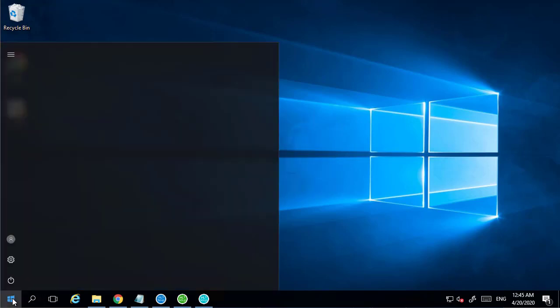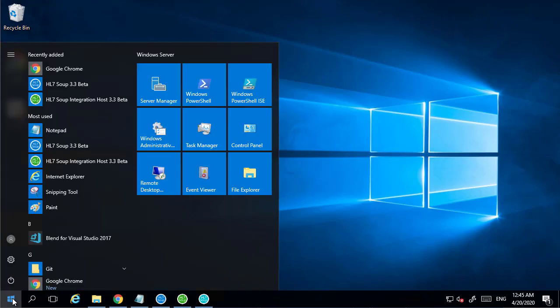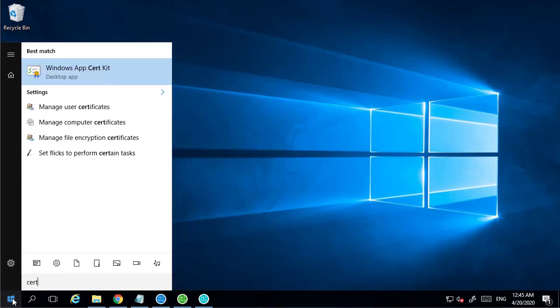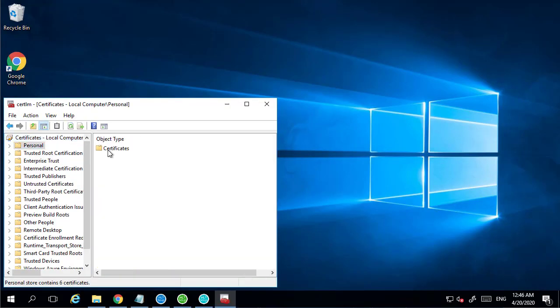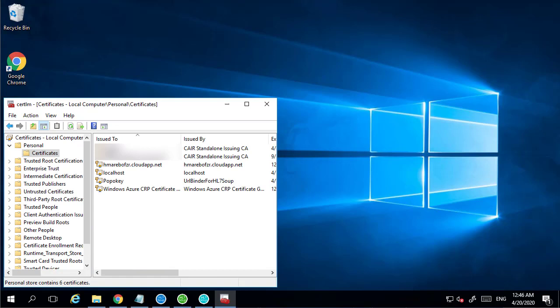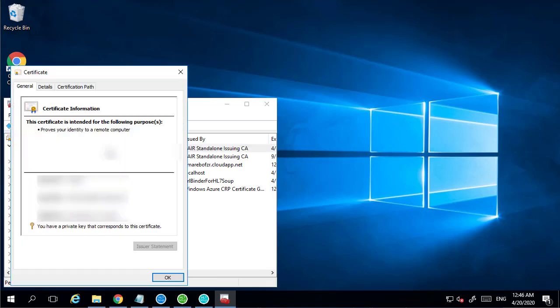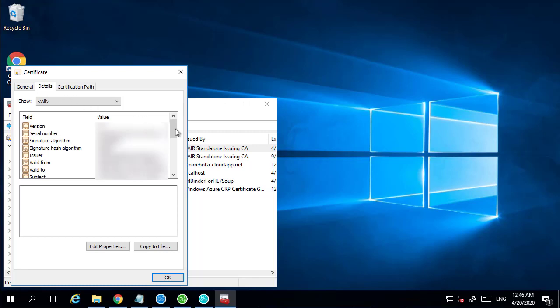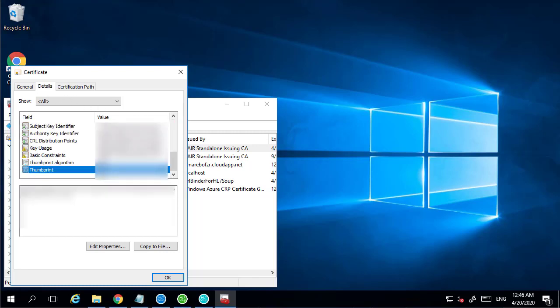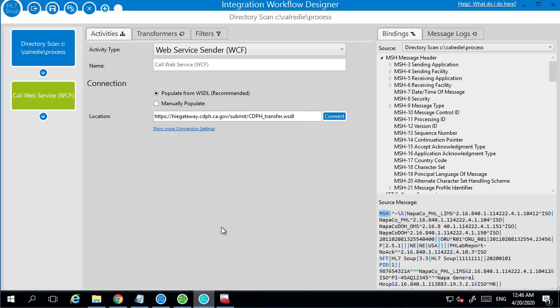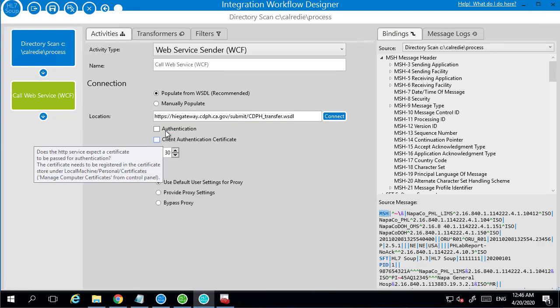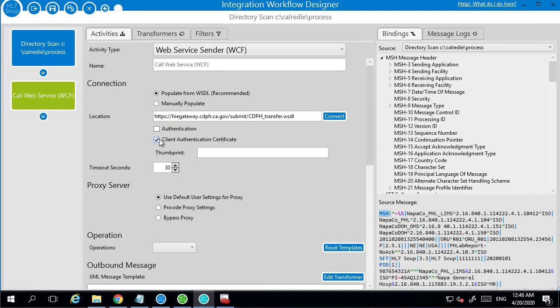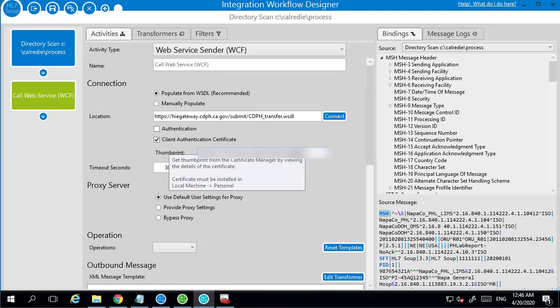There's one more detail I'm going to need to do. I'm going to need to get that certificate's thumbprint. So if I type in Cert and then I go to Manage Computer Certificates, and I go into Personal Certificates, and open up my certificate. If I now go to Details, I can get the thumbprint of that certificate. And so I can now take that thumbprint back to here. I can say show more connection settings, Client authentication certificate, and paste it in here. If you happen to have a whole lot of spaces in yours, get rid of the spaces as you paste it in.